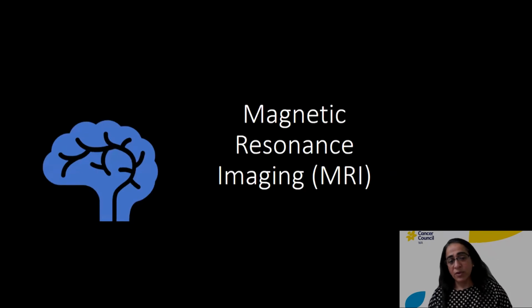Moving on to magnetic resonance imaging. MRI uses a magnetic field and radio waves to take images of the body. It is really good at imaging soft tissues such as organs, muscles, ligaments. MRI actually images water, whereas X-rays image calcium. Various organs in the body contain various amounts of water, and this information is used by MRI to create images of many organs and tissues that are difficult to distinguish on standard radiographs.